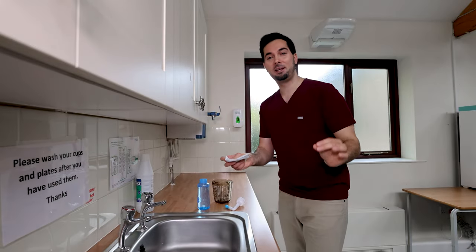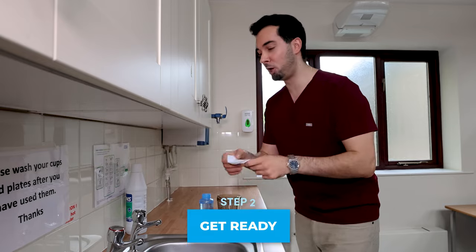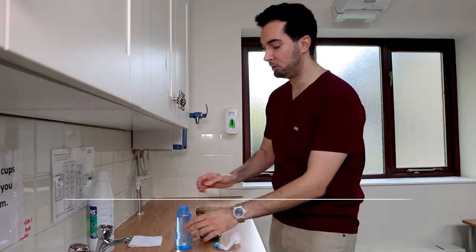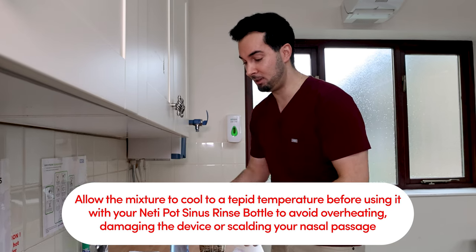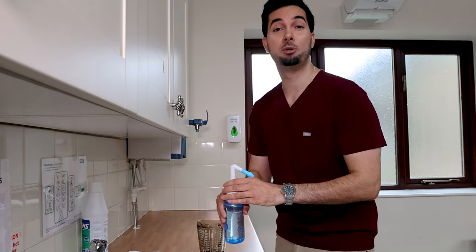Step two: getting ready. Stand over a sink, blow your nose, and wash your hands. Then fill your neti pot sinus rinse bottle to the 300ml mark with the saline solution you've just made, close the lid, and move on to the next step.